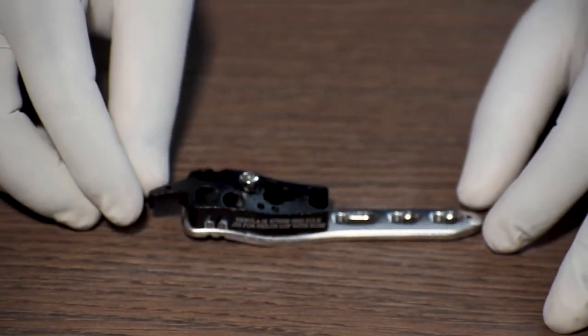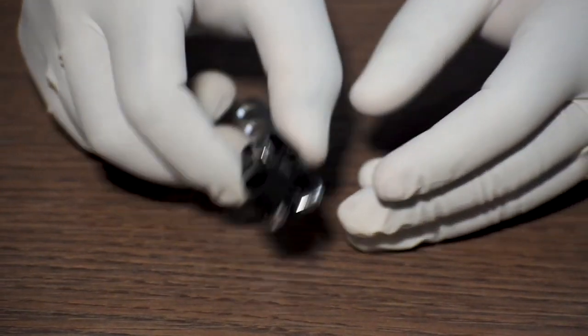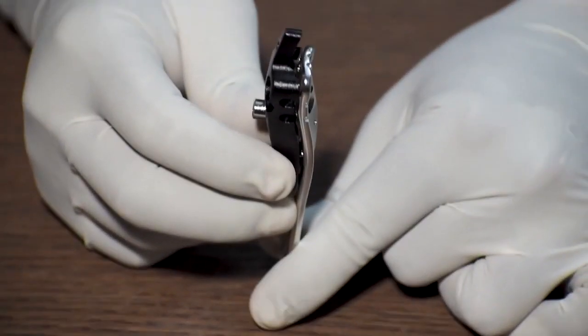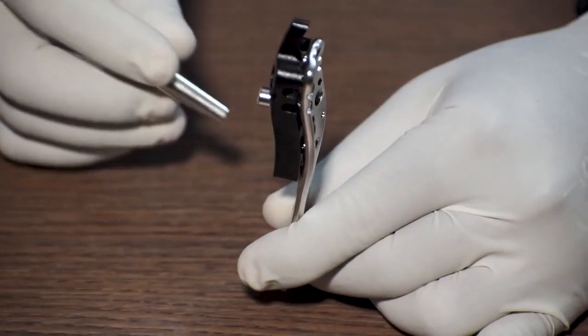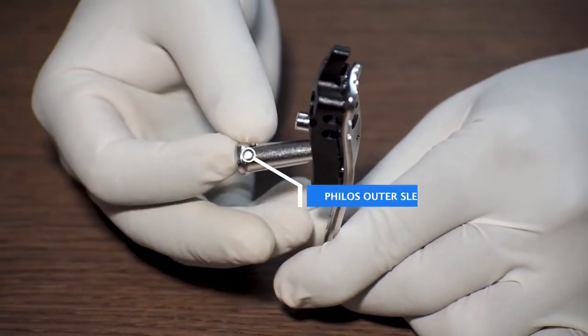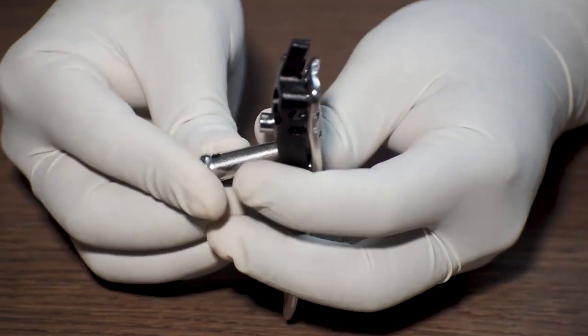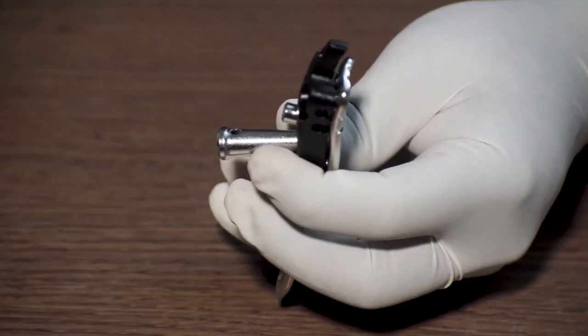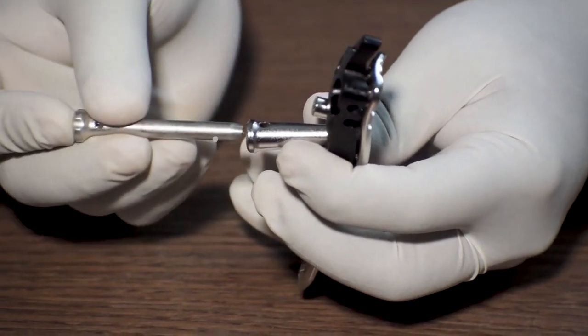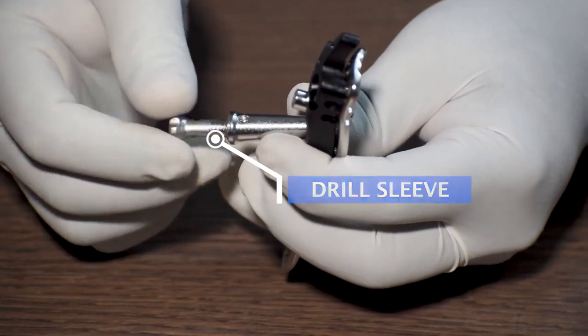Now let us check out the use of this device. First we will fix the Phyllos outer sleeve in the jig. Then we will insert the drill sleeve inside the outer sleeve.